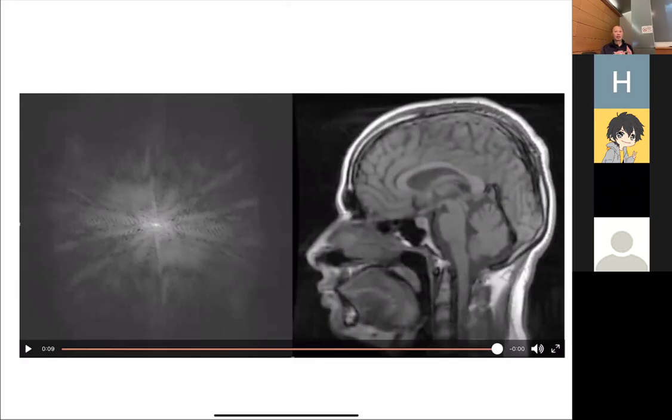Whenever you go and get an MRI scan, basically, the doctor will say, I want an image. Typically, there's a set protocol, based on their knowledge, of what resolution they want versus how much time it takes. And that's typically the trade-off. Question. And K-space is the Fourier transform of your image. Yeah. In MRI, we just call it K-space, but it is the Fourier space.